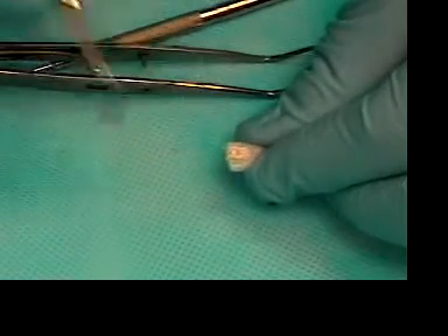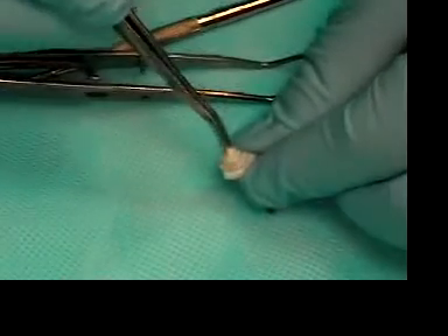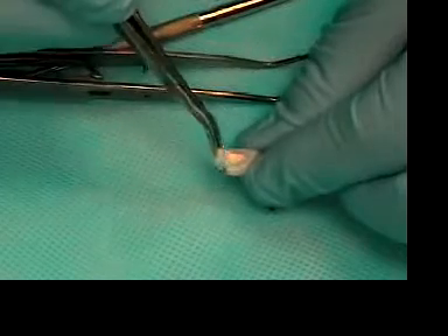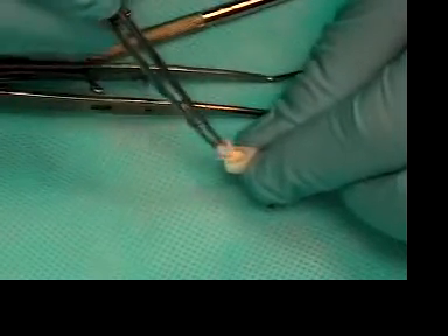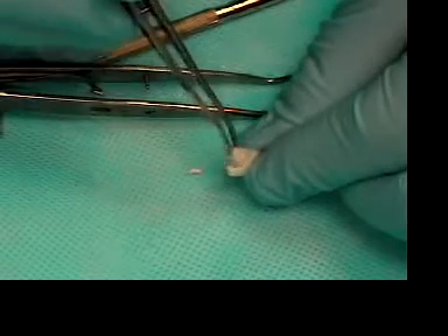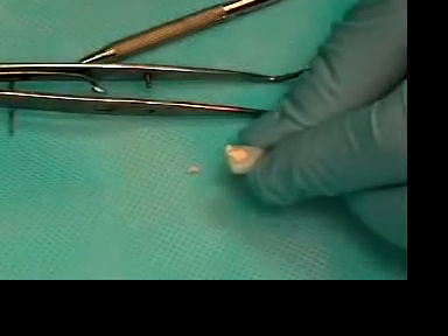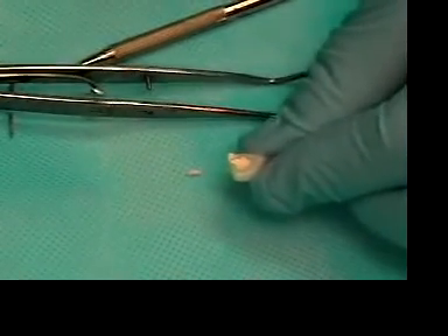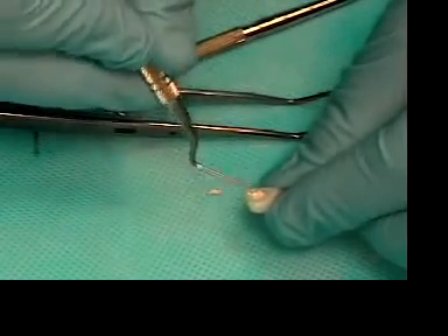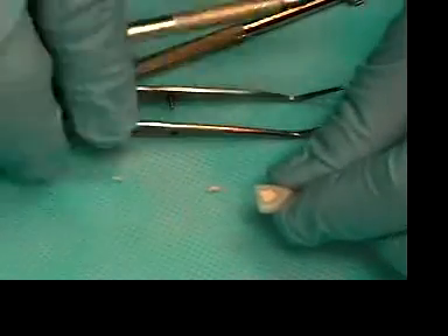You take another cotton pellet that's wet and just wipe it — there's no carving or anything else to be done. That's basically how we temporize the tooth. Take the glick spoon and just trim off some of the excess, then check your occlusion to make sure it's not in hyper occlusion.